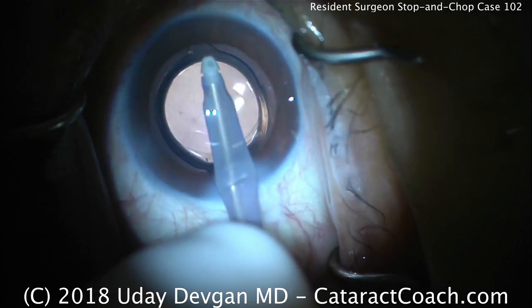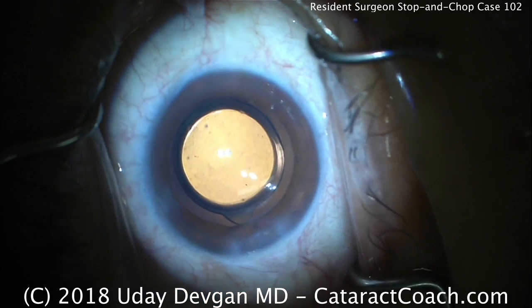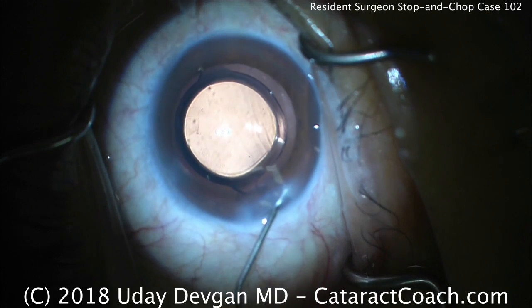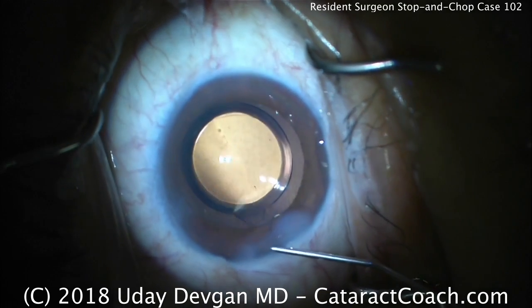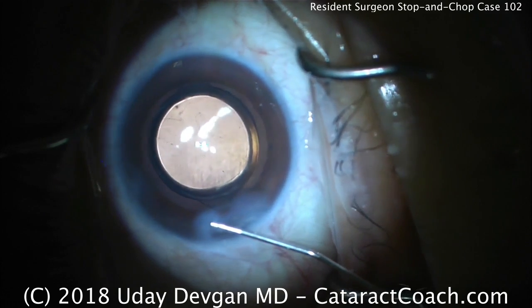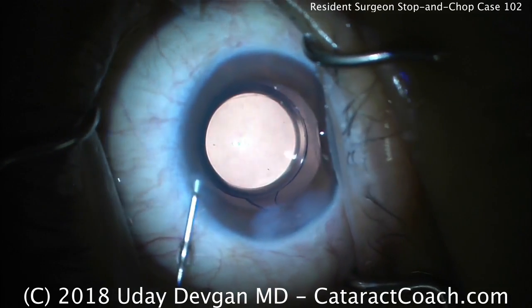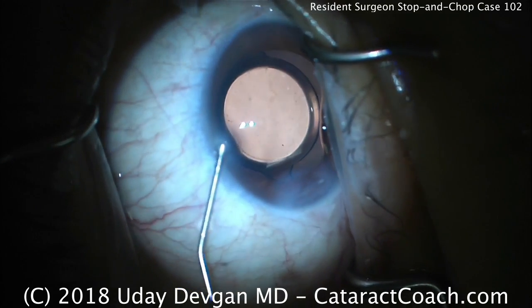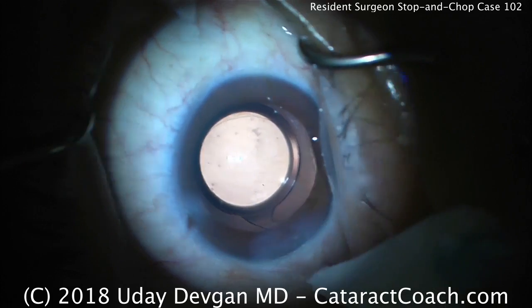Time to remove the viscoelastic. Early in the learning curve, I don't ask residents to go behind the IOL; just have them work from in front and rock the optic back and forth to allow more fluid flow to wash out the viscoelastic. Here's the corneal hydration — I don't particularly like the technique of hydrating only the corners of the incision. I prefer hydrating mid-stroma back and forth, because hydrating only the corners leaves nothing in the middle of the incision. The paracentesis is hydrated as well. The incision was very well constructed so I don't anticipate any leakage issues, though the hydration technique for the main incision differs from what I prefer. A Weck-Cel to check the incision — that looks pretty good.